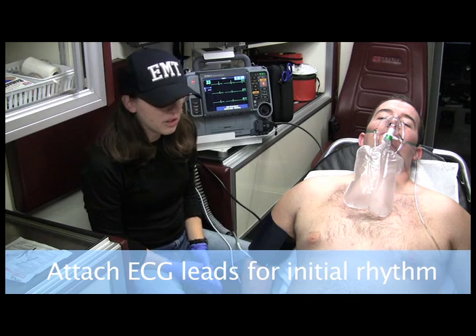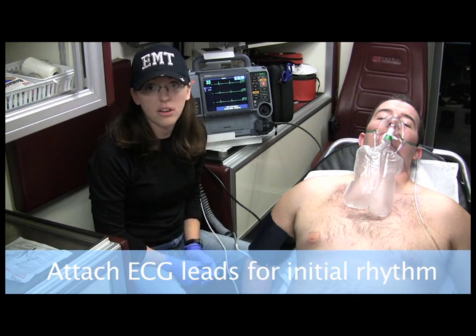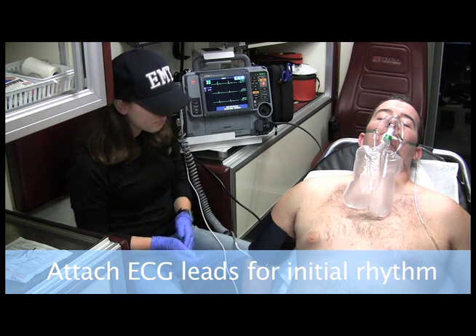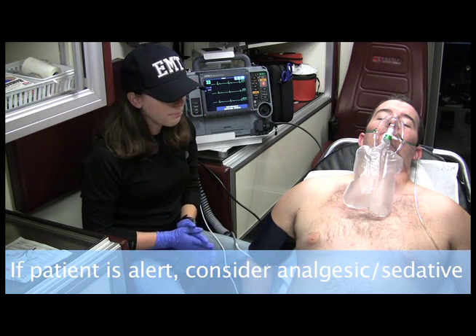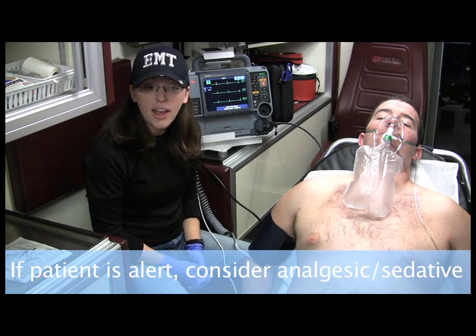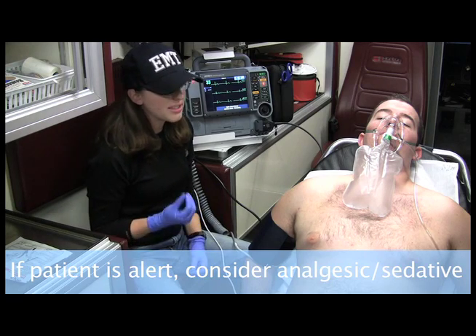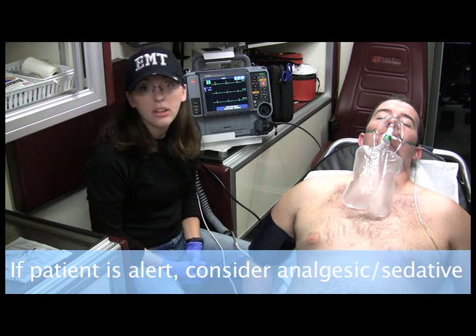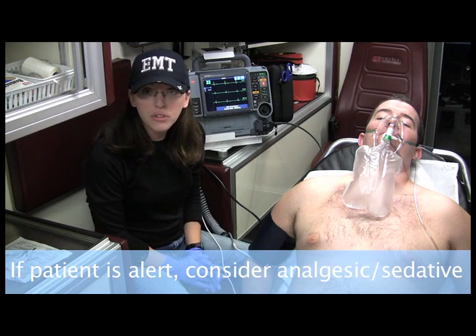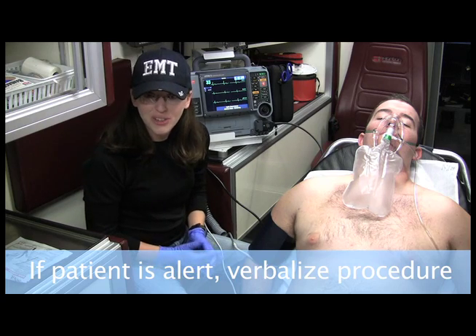My patient is an unstable patient, and I can't get venous access on him, so I want to look towards transcutaneous pacing. I want to contact medical control to see if I can get an analgesic or a sedative to give to him to help with the discomfort of the procedure. Now, it's very important to explain to the patient what you're going to do.